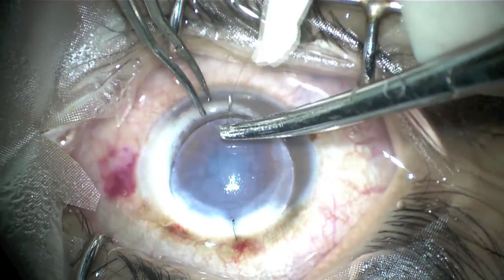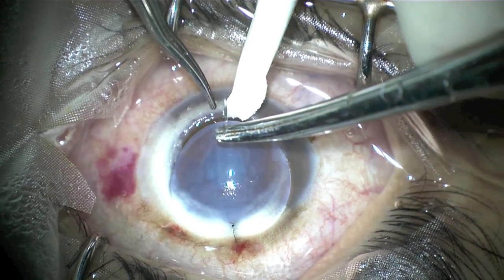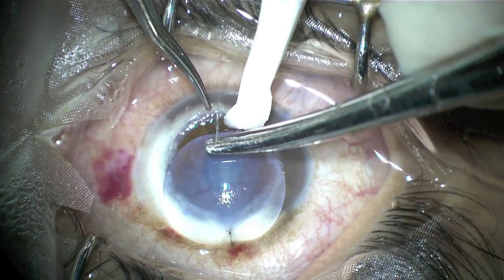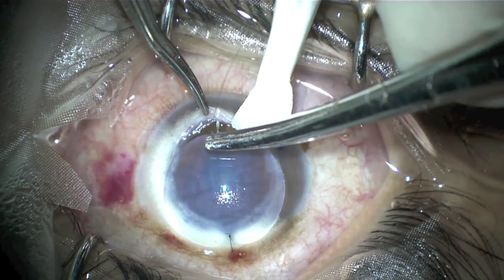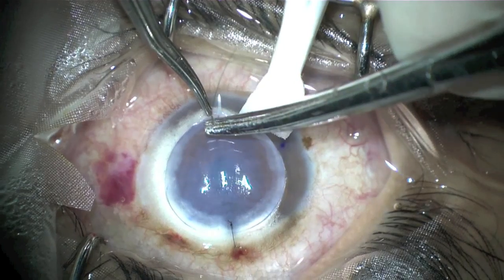Care must be taken while passing the needle through the host cornea. The interface fluid should be completely dried up with the help of a sponge, and the needle should be passed after lifting the host corneal edge.